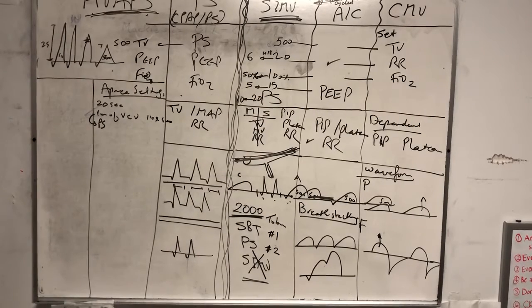So that's great, unless you're trying to do that for SBT, and it happens so frequently, and it's very difficult to convince respiratory therapists otherwise. Like I think I made maybe a 50% success in this hospital where I live, right? But still, there is a lot of culture that comes behind this, and they can't tolerate patients who are apneic. And I'm sure each one of us had heard this phenomenon where somebody comes in and says, the patient failed the SBT. And you don't ask how the patient failed the SBT, and you move on to the next patient. But if you ask, they'll tell you, oh, he failed because of apnea.